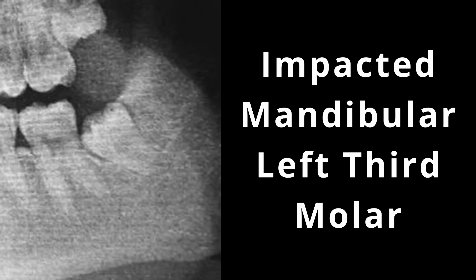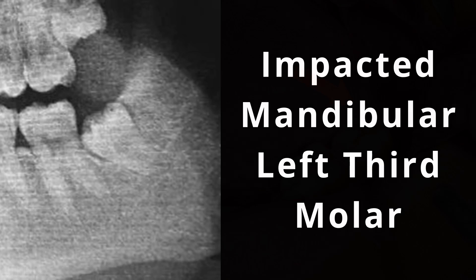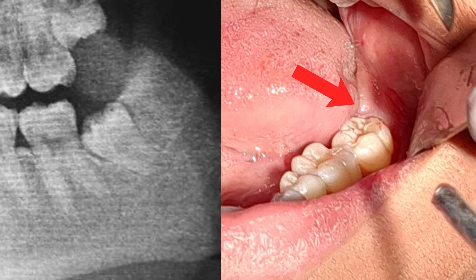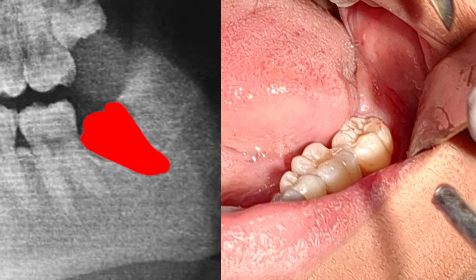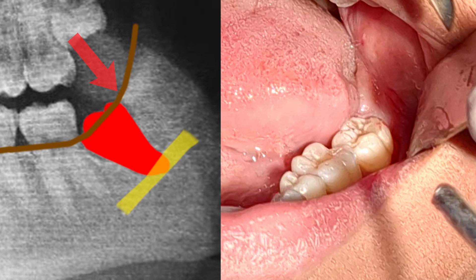Today, I am going to show you the surgical removal of an impacted mandibular third molar. Clinically, the tooth is not visible in the oral cavity. Radiographically, the tooth is mesially tilted. The apex of the root is close to the mandibular canal, and the bone distally is at the level of the distal cusp of the tooth.